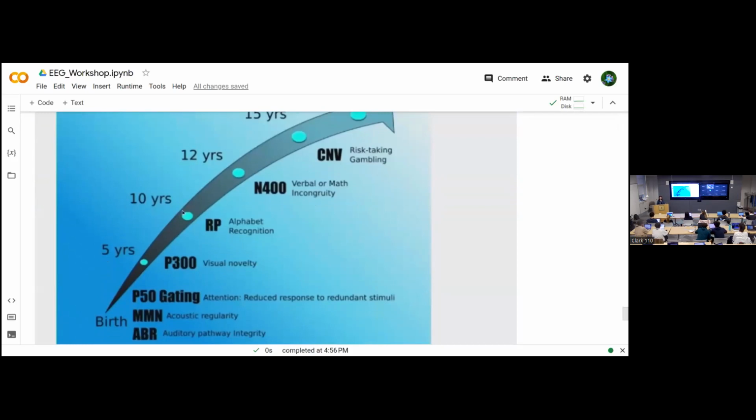You can do further research on these signals yourself, but you can see that P300 here corresponds to visual novelty. And that is what we expect with our card experiment, because when your chosen card comes up, you're getting that visual novelty. And we can also visualize the differentiation in our occipital lobe channels.